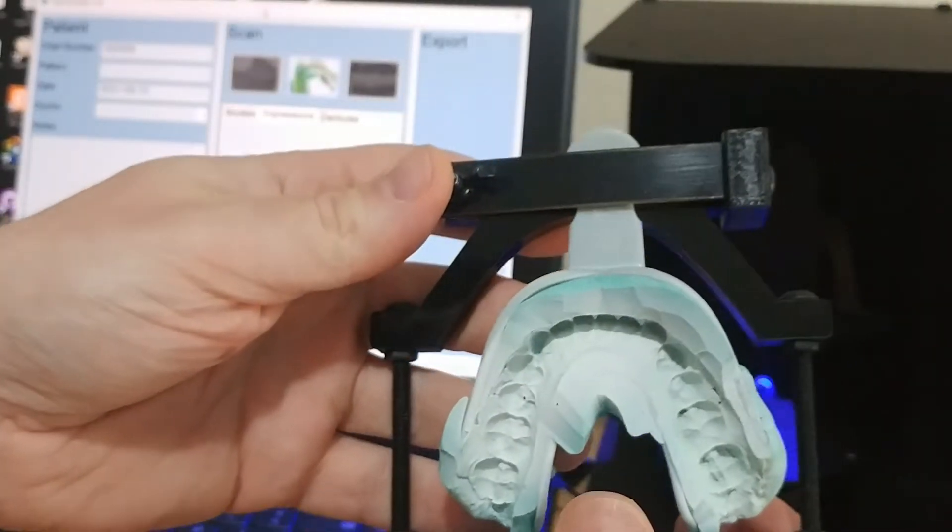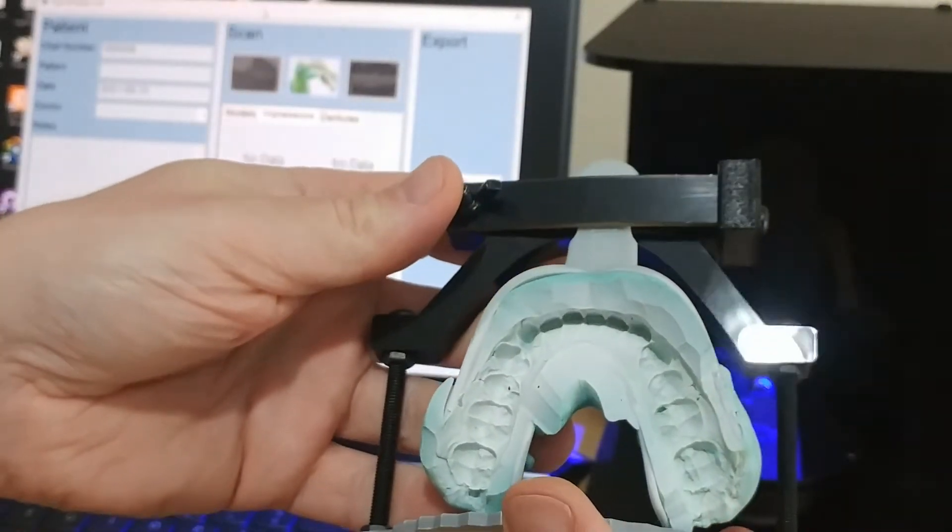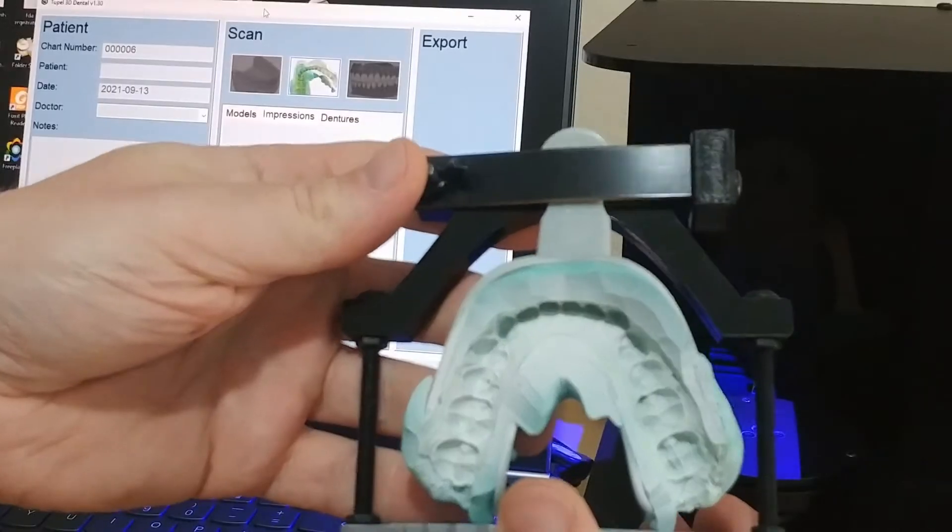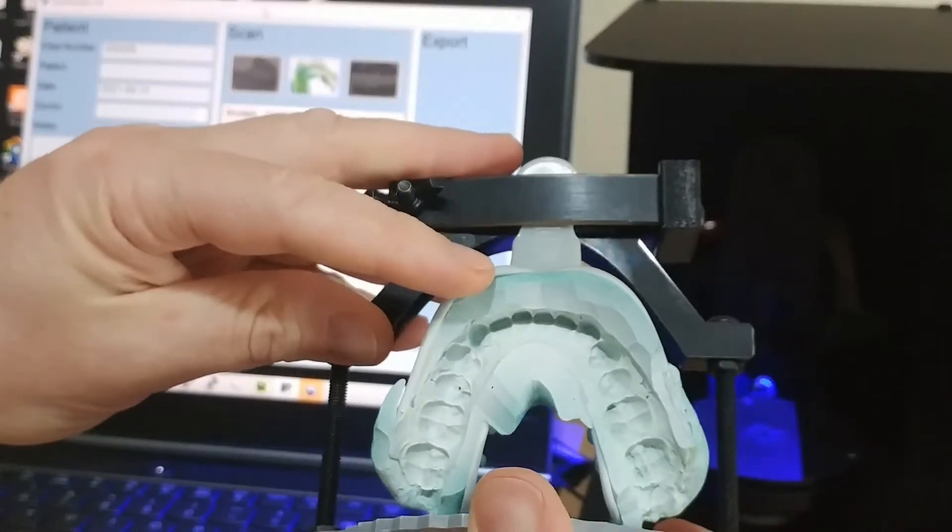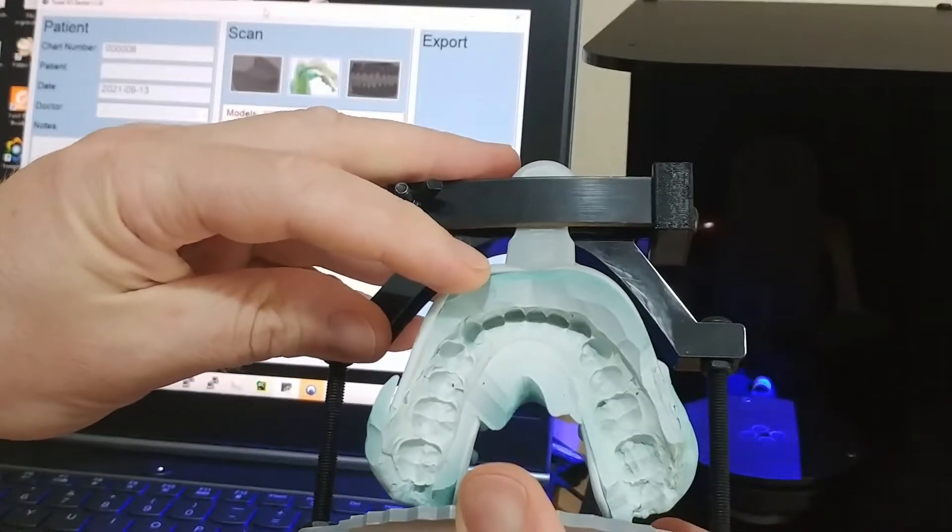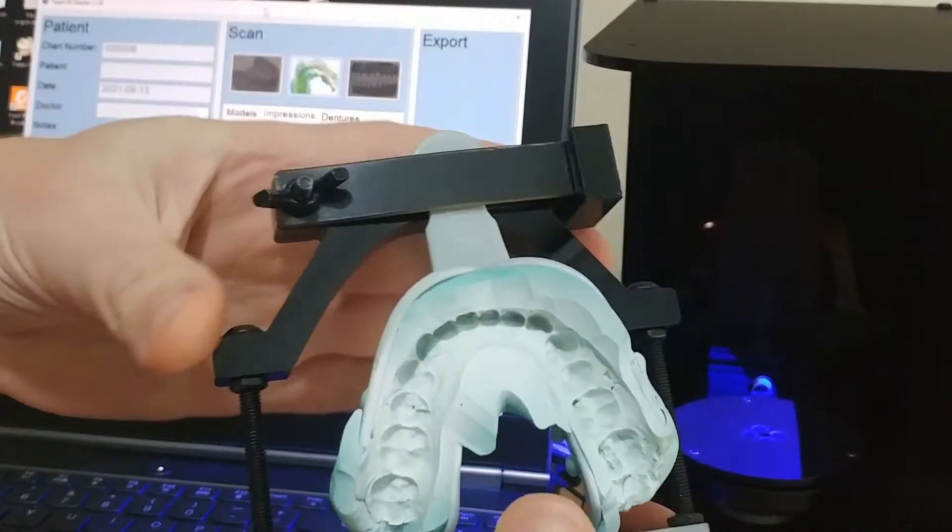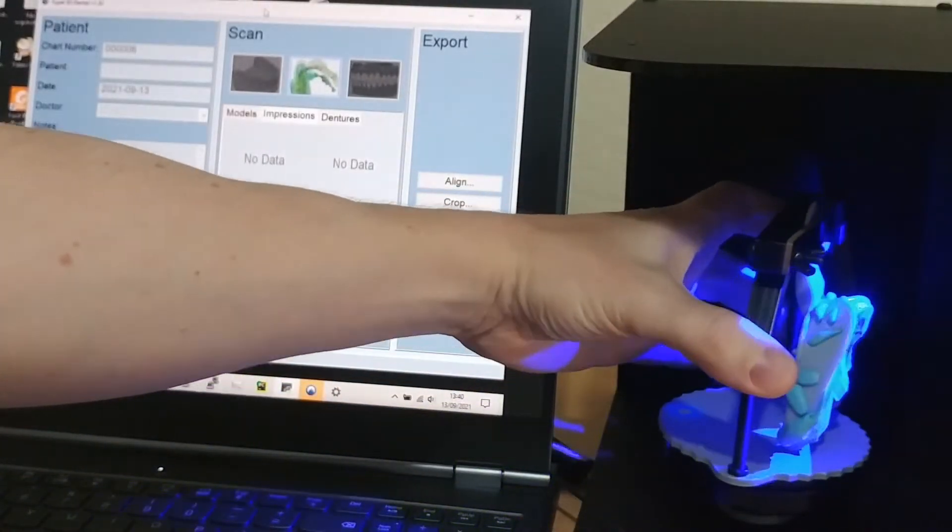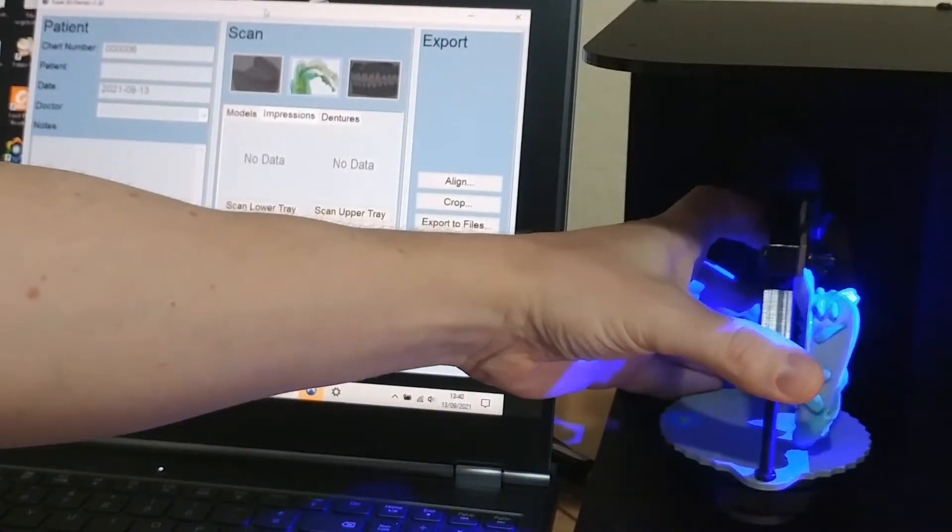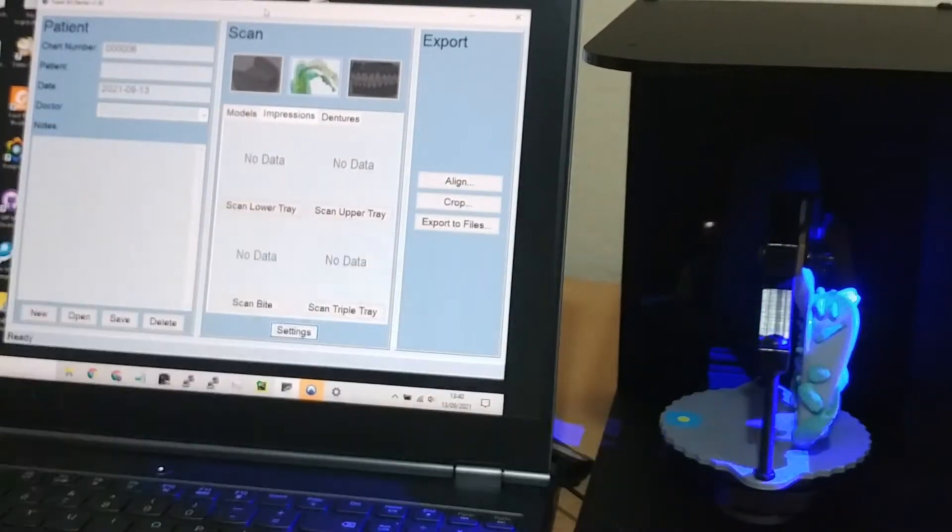Let's scan this impression directly. The scanner won't always be able to see right into the steep parts of the mould, in which case it's best to pour up the model. But I'm expecting to work on this one, we can see how it comes out.